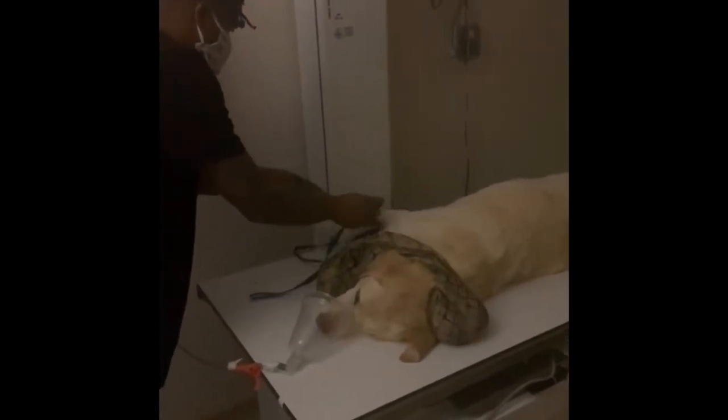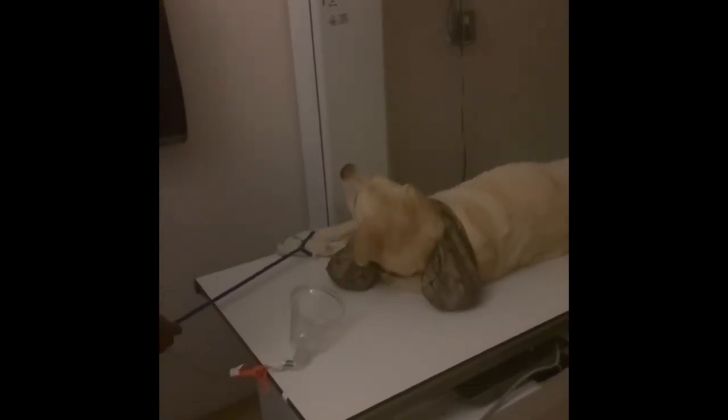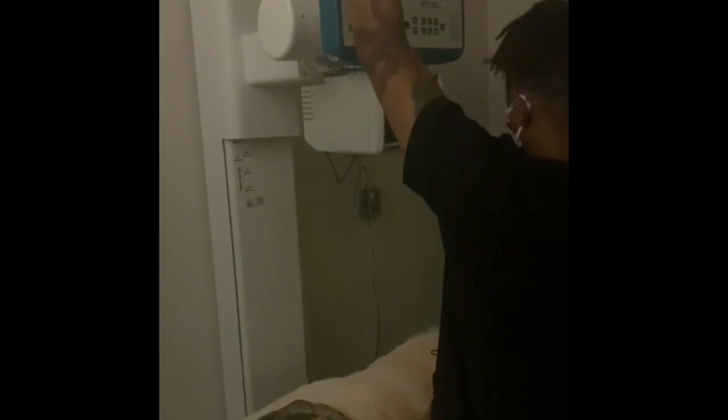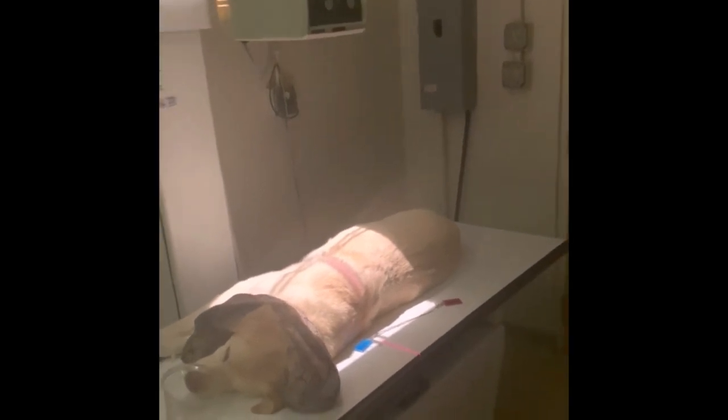This view will also start at the thoracic inlet and end at the end of his rib cage. I'll also measure the height of his chest while he's on this side and adjust the exposure for this x-ray. I'll use the left marker to indicate that this is a left lateral x-ray. Once he's in place, I'll get behind the cover and take the image.